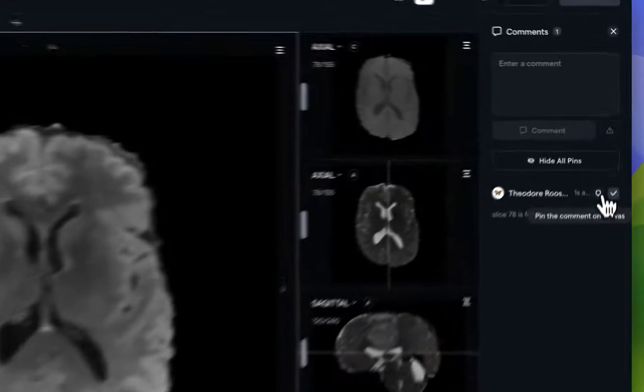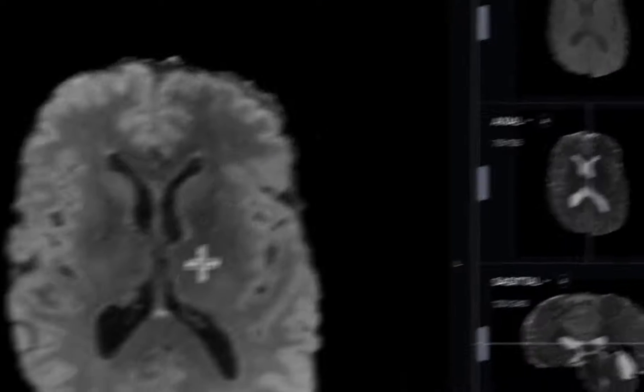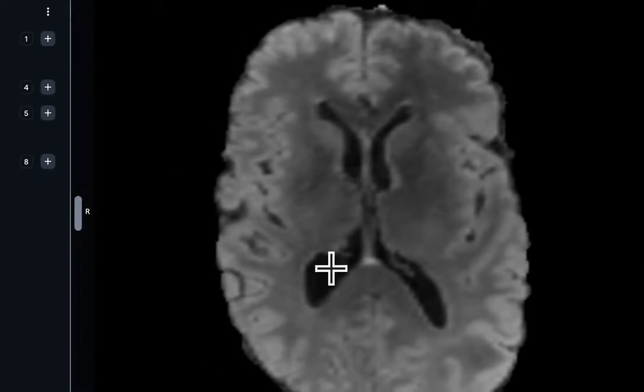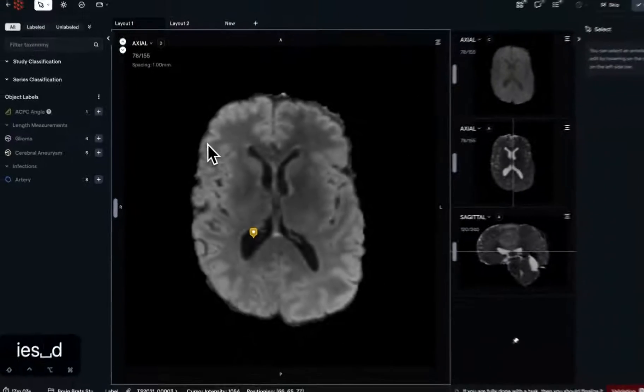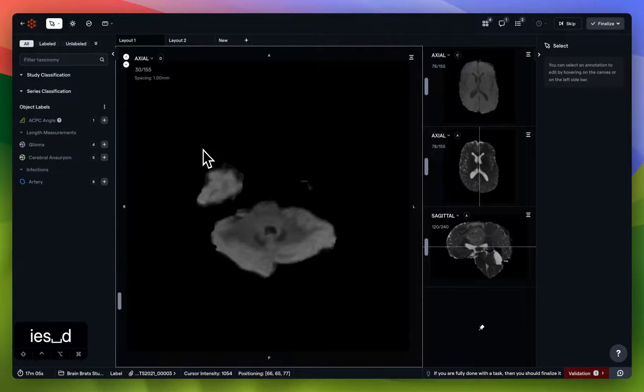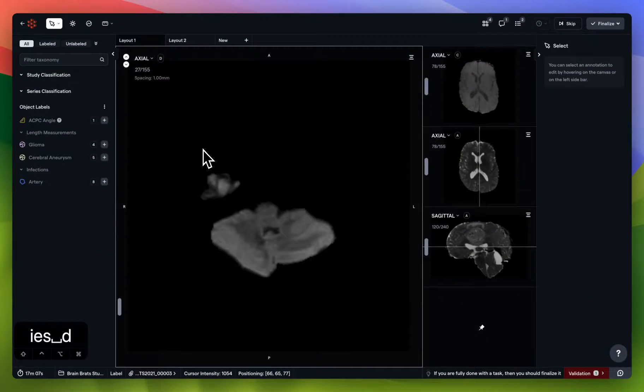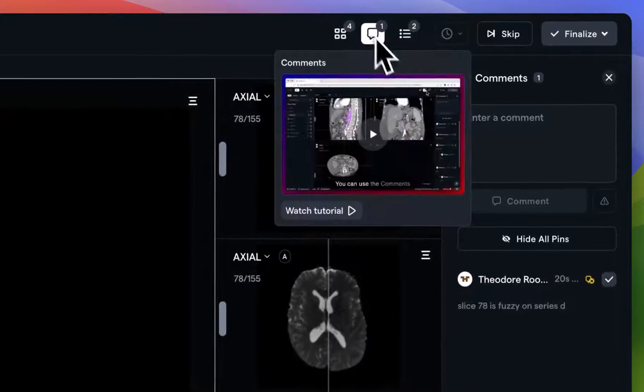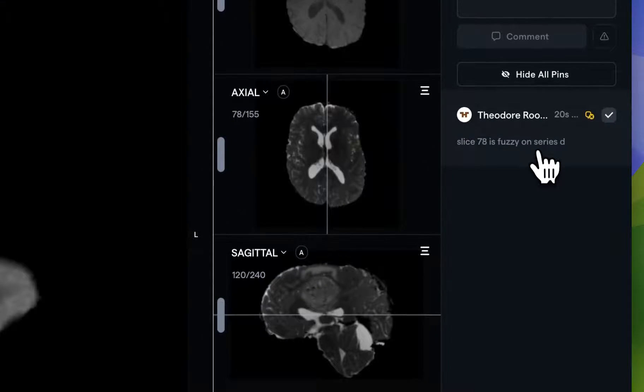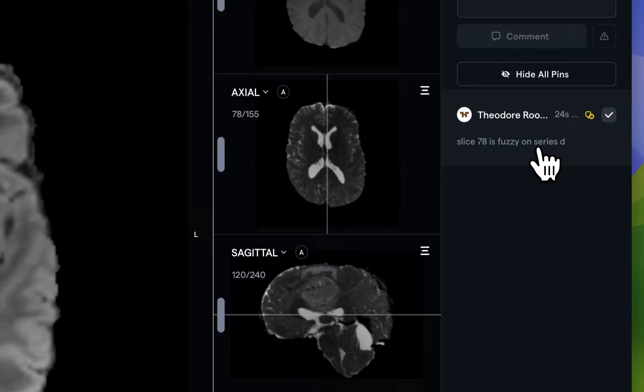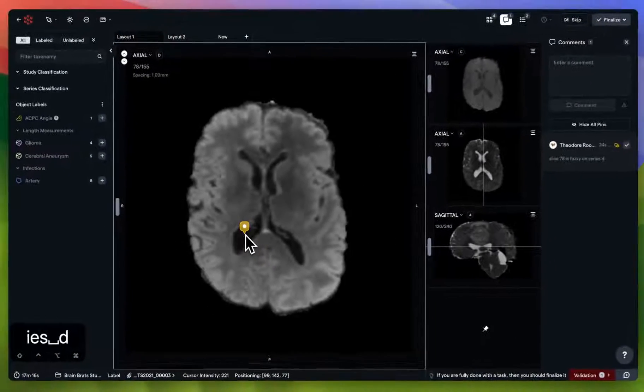Now that I have a comment that I'd like to leave for an admin or reviewer, I can click on comment to create it. You'll see that a record has been created. I can also choose to pin the comment to a place on the canvas. Let's just choose this ventricle here and scroll to a completely different slice. Pinning a comment allows other members of your team to very easily reference it. All they have to do is click on the comment, and they'll be instantly teleported to the slice.